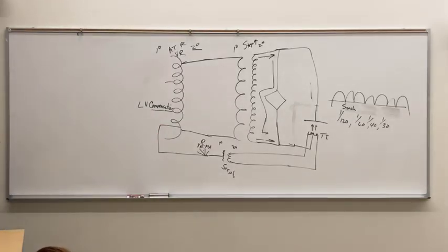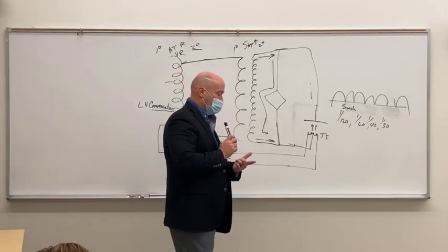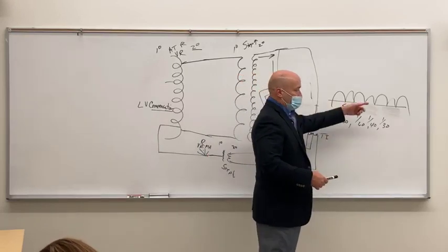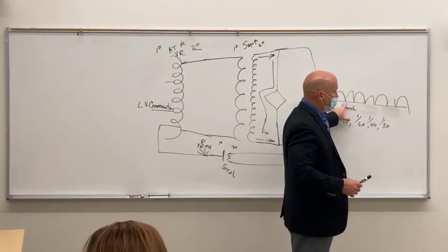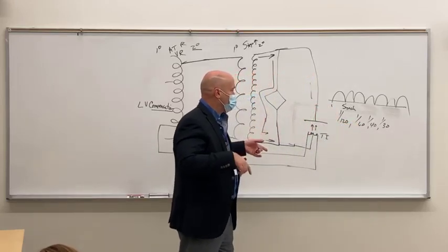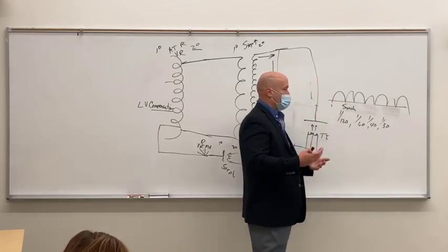So we talked about manual timers, you just don't see those anymore. We talked about electronic timers, and electronic timers are what you work with now. Electronic timers allow for the shortest exposure time, and they're the most accurate. I can't logically make the leap of understanding how this could be any less accurate than an electronic timer, but whatever, we'll go with the literature and say electronic timers are the most accurate.